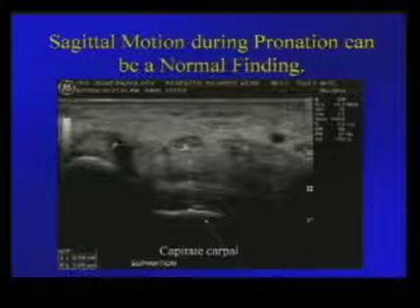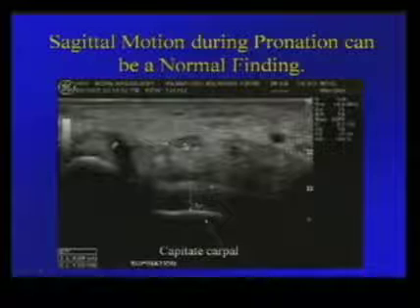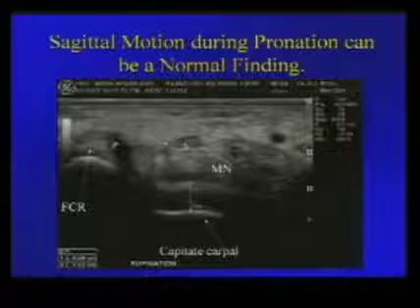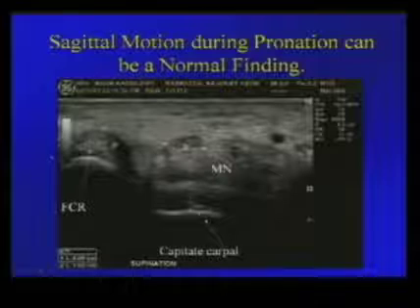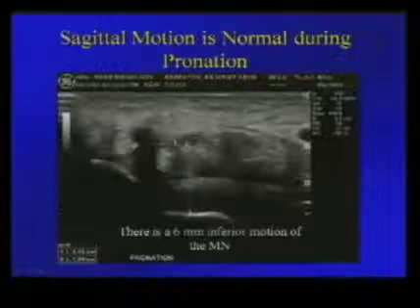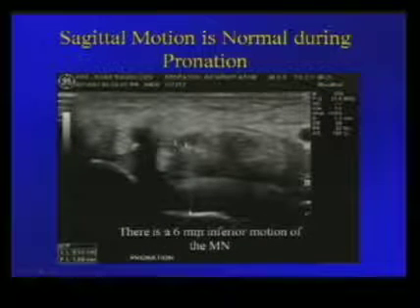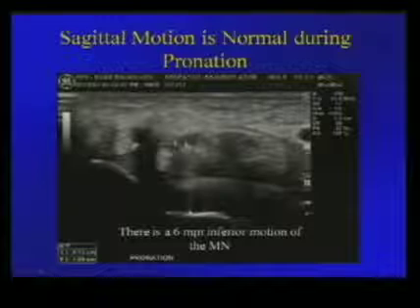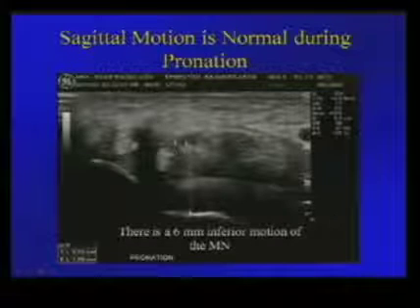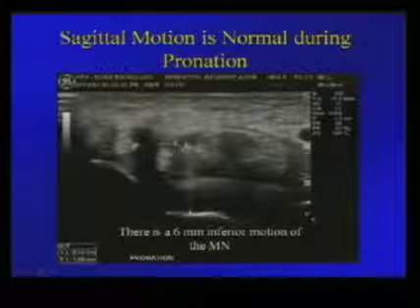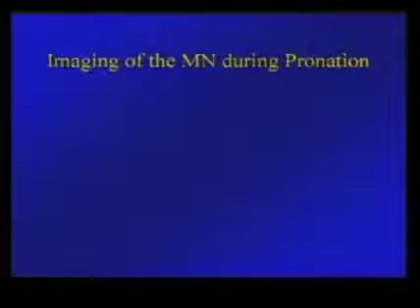Showing that movement relative to the capitate bone: in a normal volunteer, the median nerve and flexor carpi radialis are shown relative to the capitate bone. In this volunteer, there was about six millimeters of dorsal movement of the median nerve relative to the capitate.